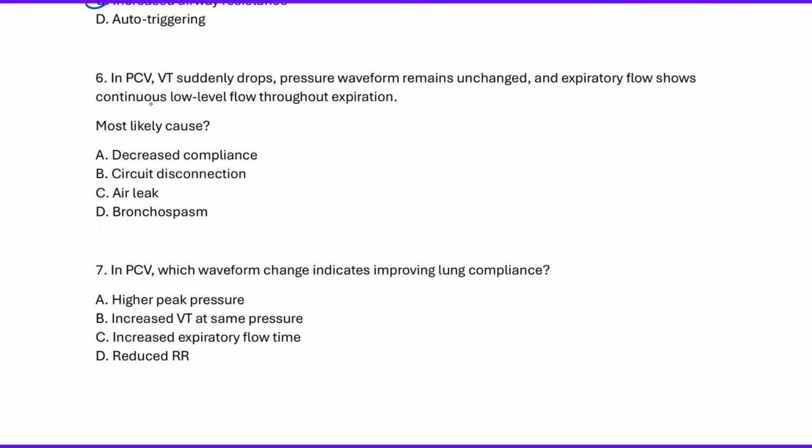In pressure control ventilation, the tidal volume drops suddenly and pressure waveform remains unchanged, and expiratory flow shows continuous low level flow throughout the exhalation. So during inspiration, there's no change, but when you look at the flow waveform and when you look at the expiration phase, that's when there is a decrease. So this tells me that there is no problem with air going into the lungs. It's when the air is coming out, that's where the air is disappearing to somewhere else instead of coming to the what? To the ventilator. So this tells me that this patient is having what? Air leak.